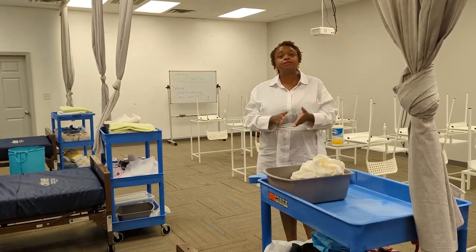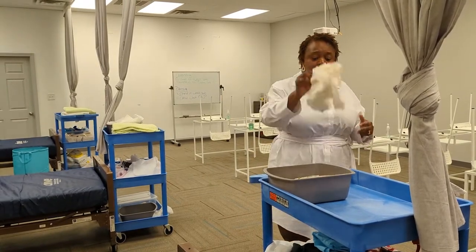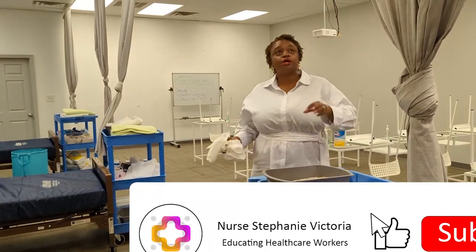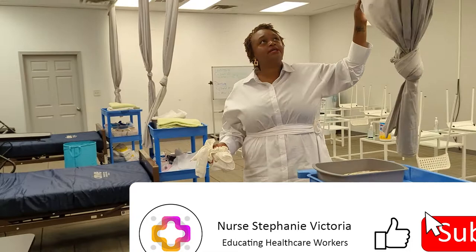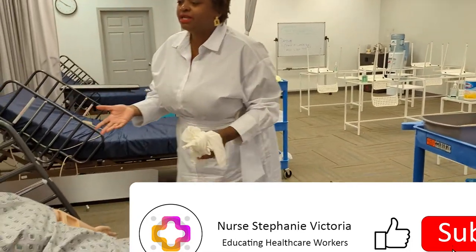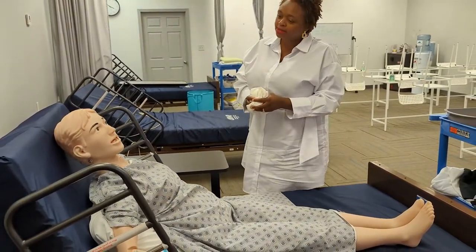Prior to every skill, I've done a soap and water hand wash. Gather supplies, and then knock, enter, close my privacy curtain. Hello, my name is Stephanie. I'm your nursing assistant. I'm here to place the anti-embolism stockings on.